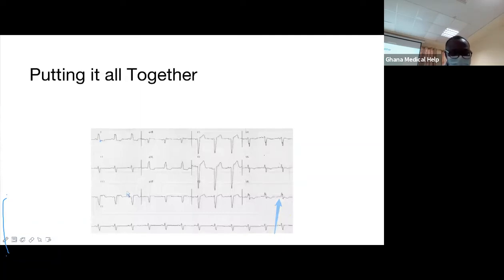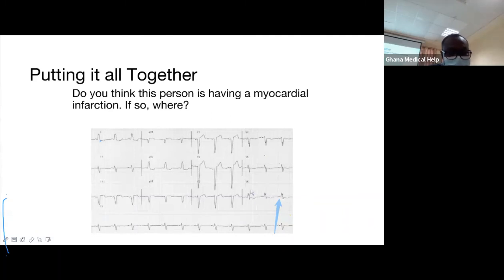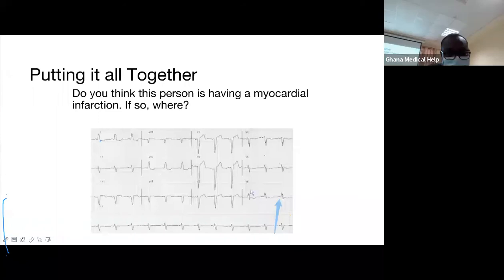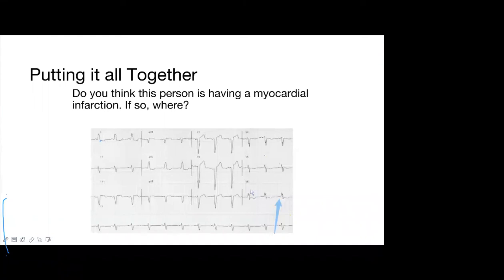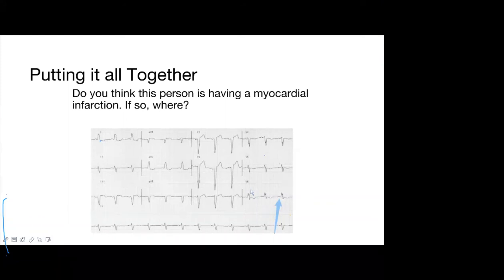Very simple. Those on the Zoom, do you think this person is having a myocardial infarction? Anyone who wants to answer should go ahead. Pascal, the guy likes to unmute himself. Pascal, answer the question since you are unmuting yourself. My system is not working well.